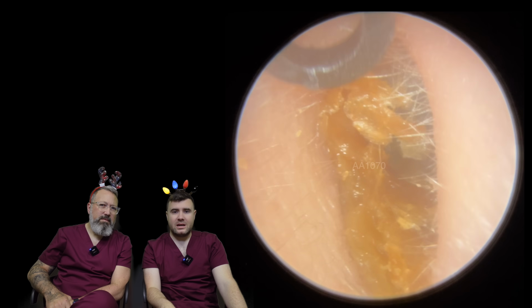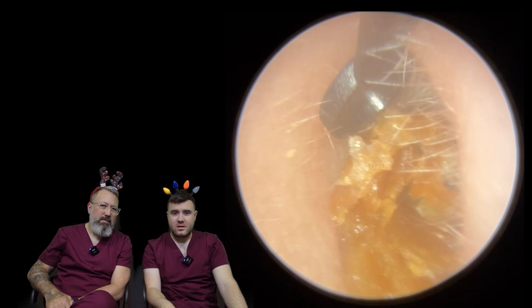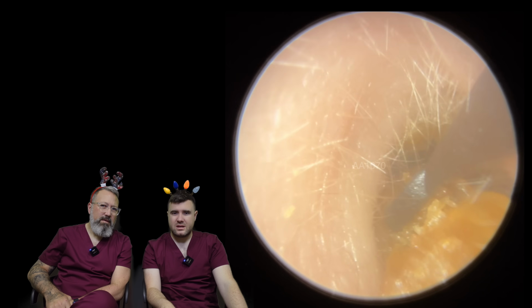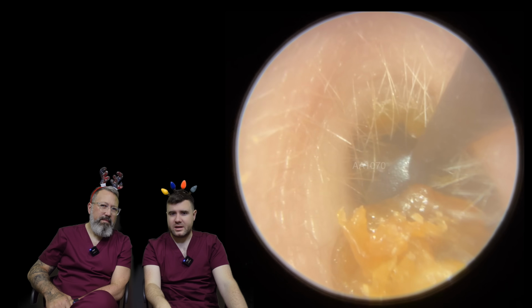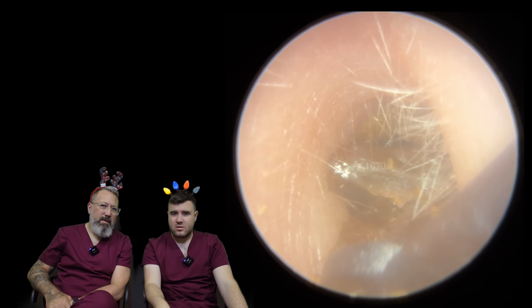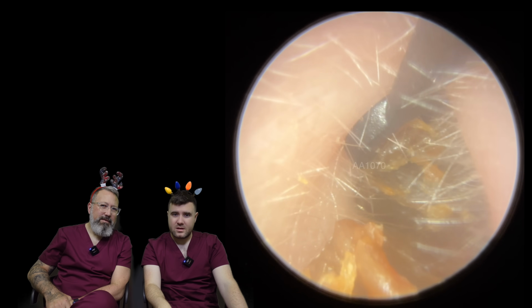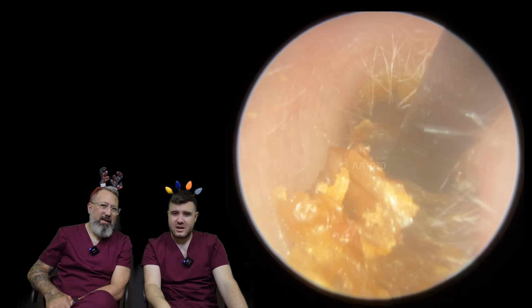So we've managed to break a little bit away, and I've decided to go in with the Jobson horn. This is the thicker Jobson horn, the round one. I'm trying to just draw it forwards and creating a little gap there now. Oh, you can see it just starting to almost roll up. It's almost there, isn't it? It's just trying to nip behind it.